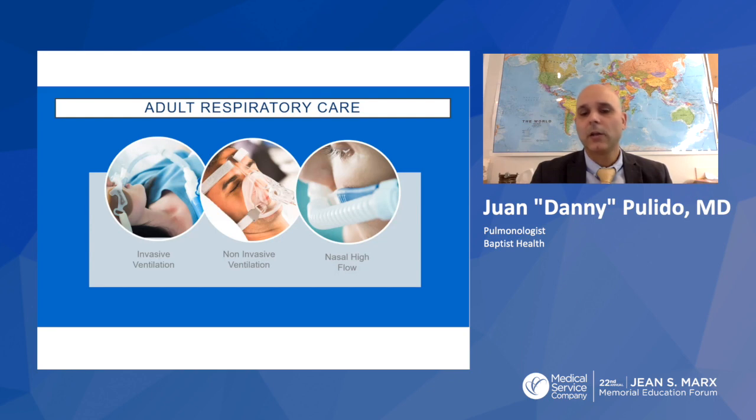Now, our experience in the hospital setting has allowed for patients to be more mobile in the room, active in work with physical therapy, occupational therapy, speech therapy. But as we see the transition of high flow equipment and services utilized in post-acute care, we are now having patients doing their physical therapy in a post-acute skilled nursing facility on high flow, and it's portable and it can be walked around the physical therapy lab or the gym as they're doing their ambulatory exercises and or cardiopulmonary exercises. And we'll talk a little bit more about how this can be utilized in a home setting.